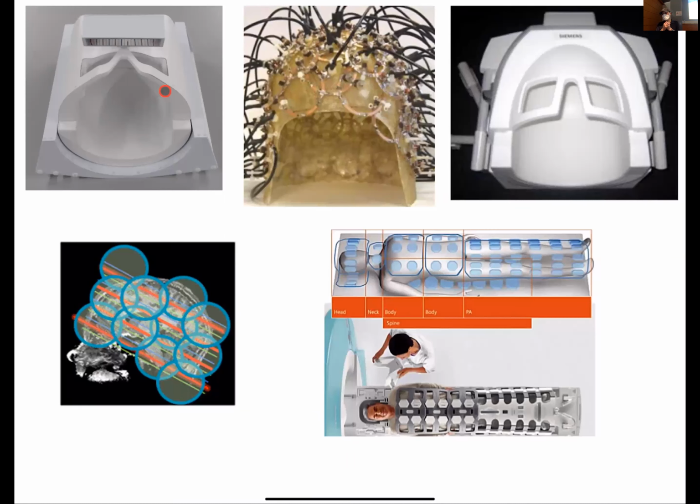Then about 20 years ago, people started playing around with multiple coils, and then they realized they could use these multiple coils to go faster. And remarkably, that innovation was done by two graduate students, one in Switzerland, one in Boston, and they came up with different methods. So the bread and butter of what we see today with parallel imaging was basically invented by people like you.